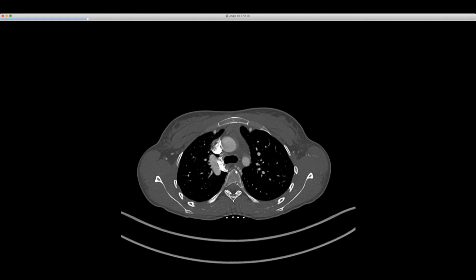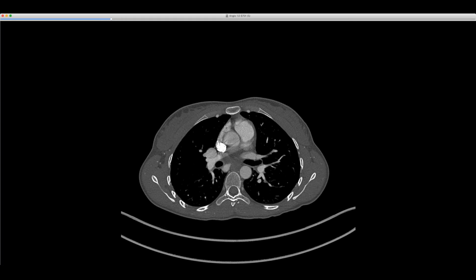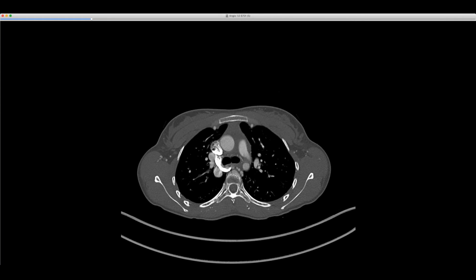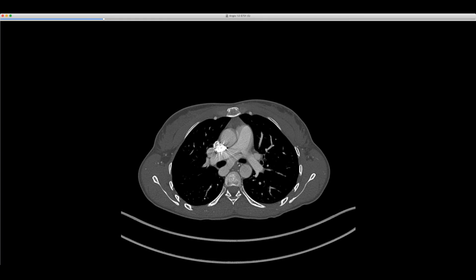that crossed left of midline, correct? Because it was like a pseudo scimitar. But yeah, this is the opposite. This is a left-sided vein crossing to the right. But those meandering pulmonary veins that we've talked about in this conference before have been in the lung. They've not crossed the mediastinum.